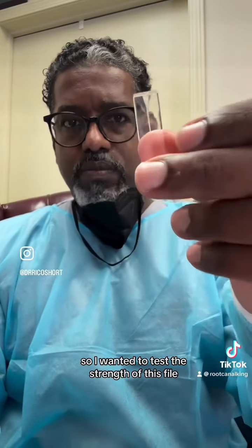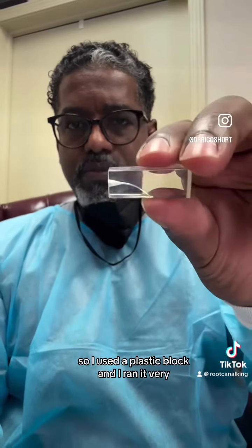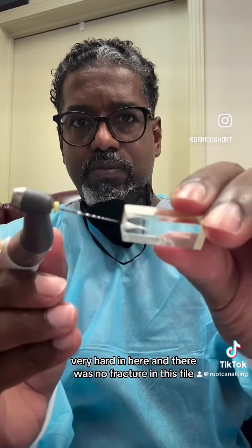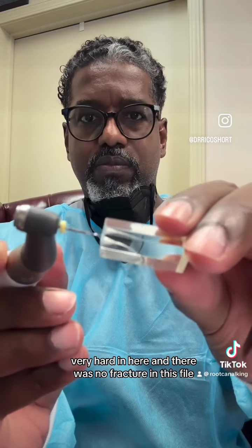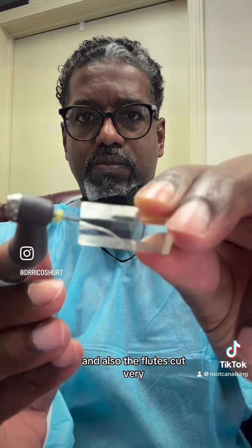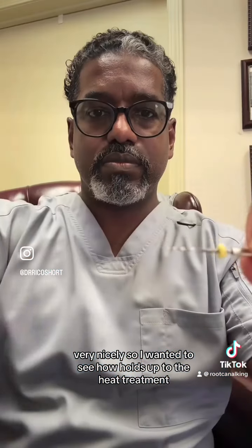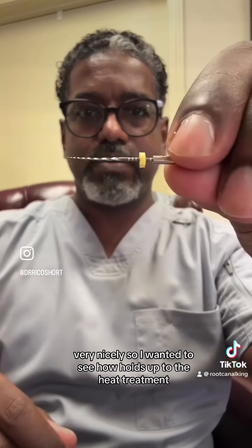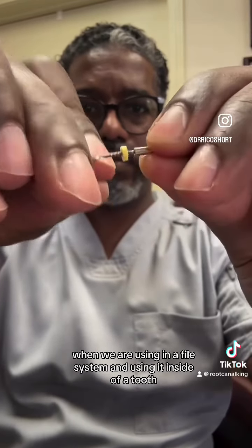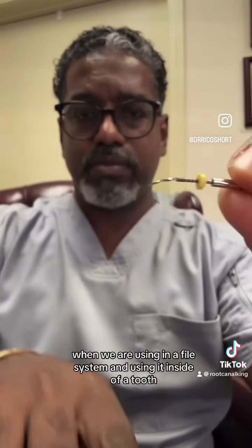So I wanted to test the strength of this file, so I used a plastic block and I ran it very hard in here, and there was no fracture in this file, and also the flutes cut very nicely. So I wanted to see how it holds up to the heat treatment and how flexible it is when we are using it in a file system and using it inside of a tooth.